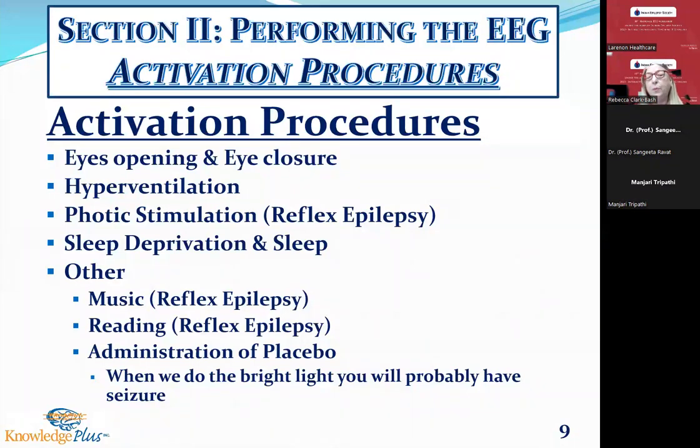Next, I really like to do photic stimulation. Here's the reason I like to do photic stimulation next. First of all, it's exciting to the patient. If they're coming into the room, my biggest goal, especially with suspected complex focal epilepsy, which used to be called complex partial epilepsy, is this: that seizure classification is one of the most difficult to diagnose because a lot of the behaviors don't look like seizures.